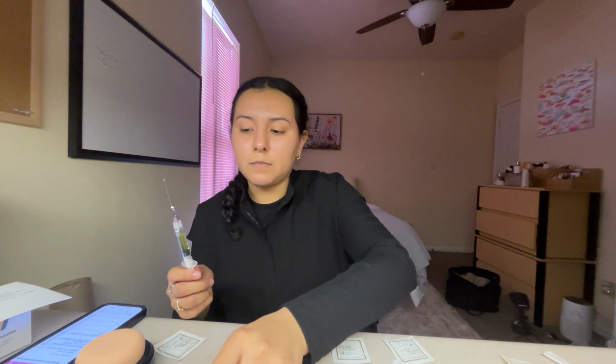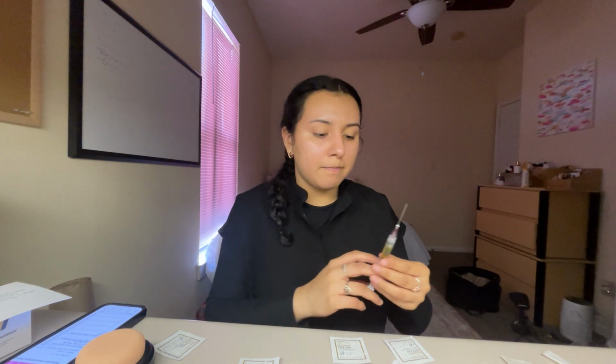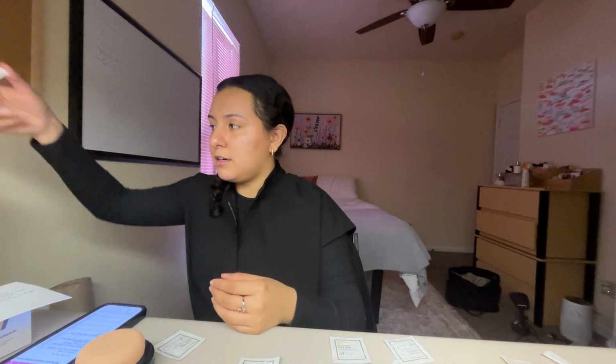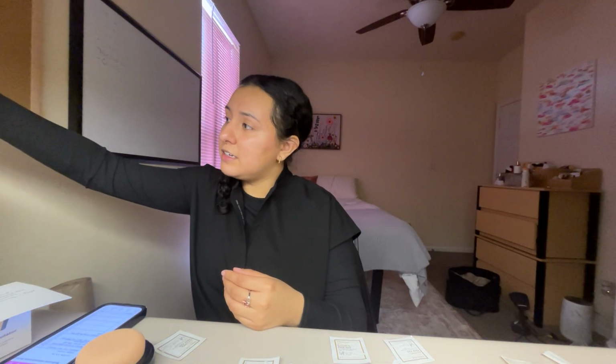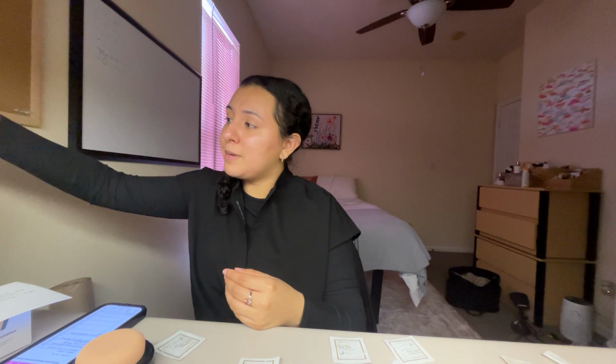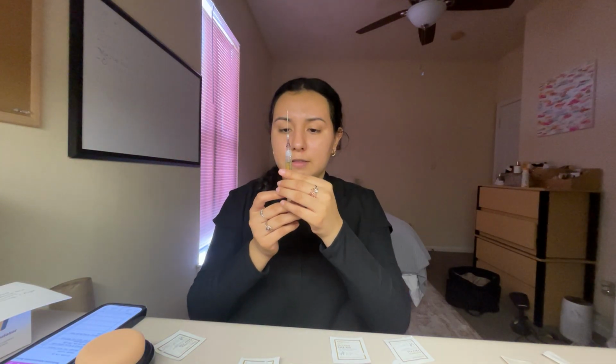Okay, so I would hypothetically waste it to have the 0.5, so I'm just gonna say that I wasted it in here. And I would also make sure that I have somebody in the room with me when I'm getting rid of narcotics.